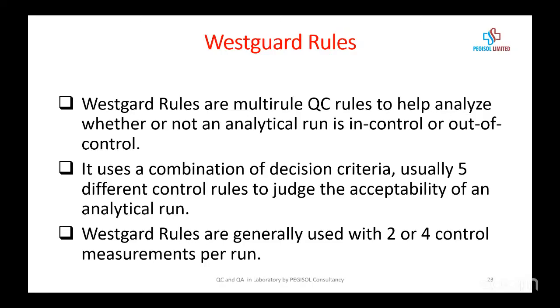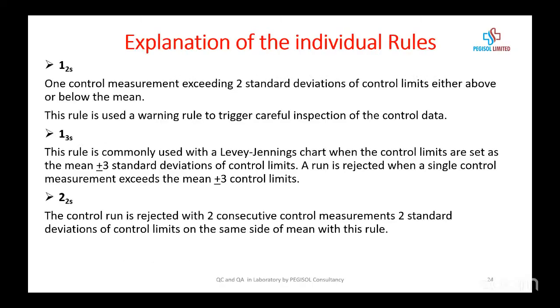So we'll get to understand the statement. Let's look at the individual rules. Please read them within yourself. I give you 1 or 2 minutes to read them: 1-2s, 1-3s, 2-2s.